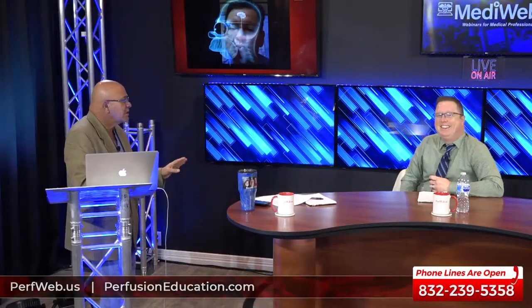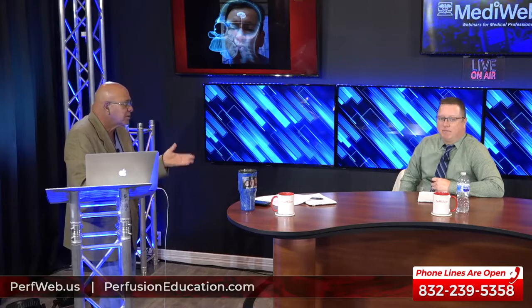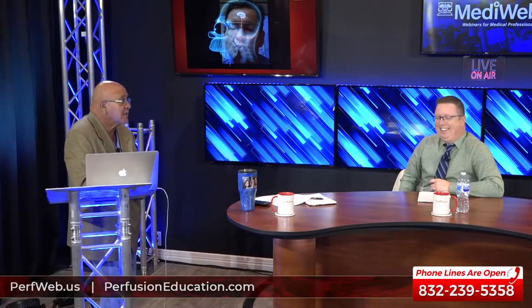It makes no sense to me whatsoever to leave it on. Even if you lost a couple of hundred cc's, you're never going to get it back from the pump, and you're running the risk of clotting your pump off. Just use the cell saver. I have a much better chance of giving those red cells back to the patient than if you put it over here. I turn the pump suckers off as soon as the protamine is in somebody's hand. As soon as I hear the P, and they don't get to the E-N part, I've already got it off. I'm not doing this.